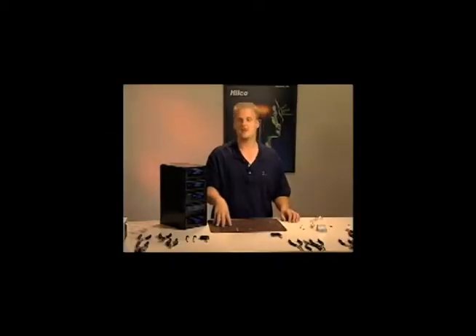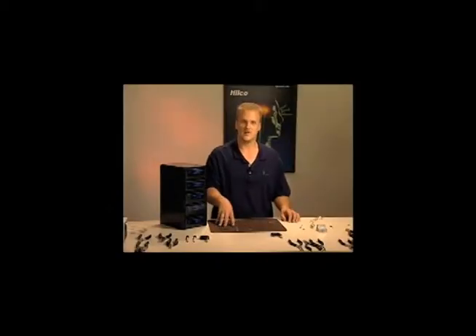Also contained in the kit is an assortment of temple tips whenever we need to replace those as well. So typically, any of these or all of these are inventoried at any particular practice.